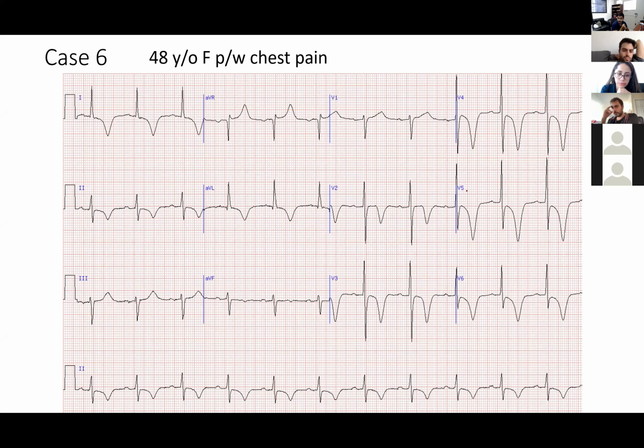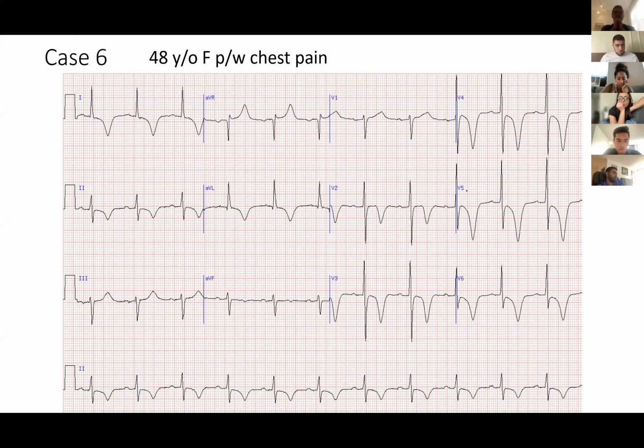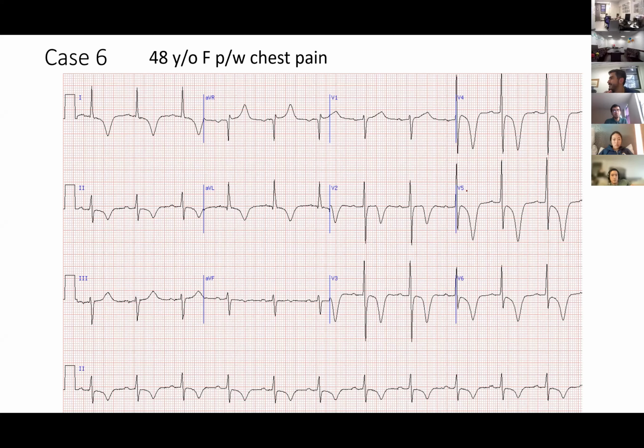I'm just going to pick Julia, but I think I can't. Noble, I know Noble. Noble? Are you there? Okay. Yeah, hey, great. Hey, how are you? I'm good. Yeah, let's see if you can tell me a little bit about this EKG. And again, just go general, maybe the first 3 steps, always do them.